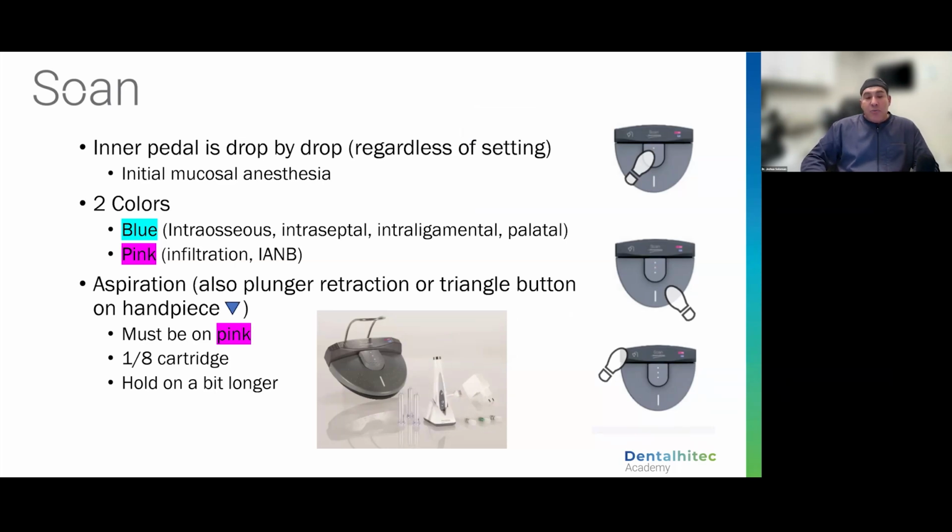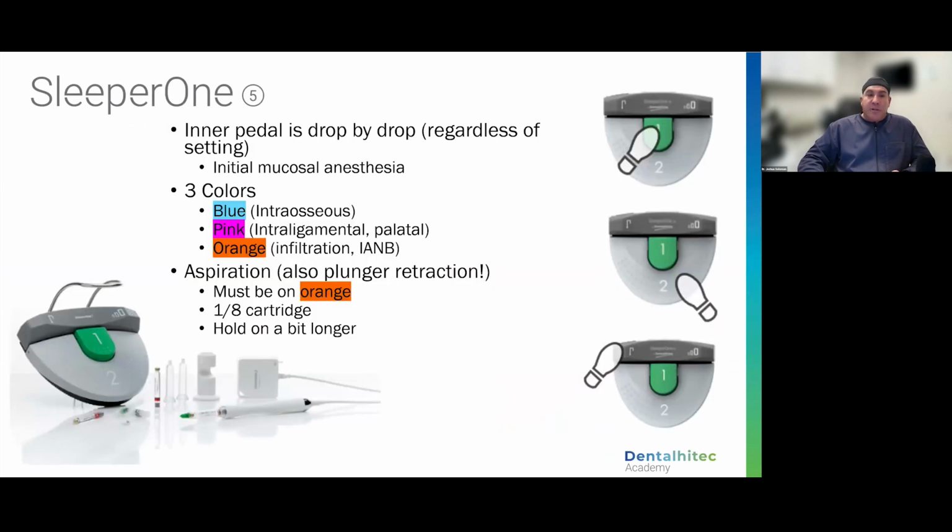The one time that I do have this in pink, and I'll talk about this here in just a minute, is for exfoliating primary teeth. I don't give IO for that. Typically, if there's no roots left, I'm going to put it in pink and just give drop by drop and get soft tissue local anesthetic.